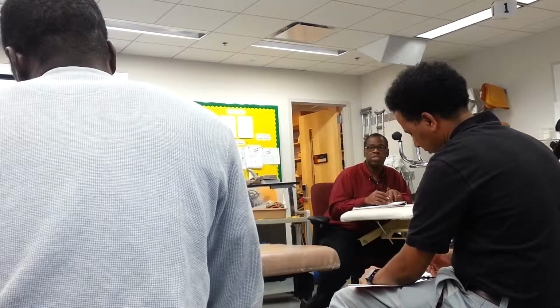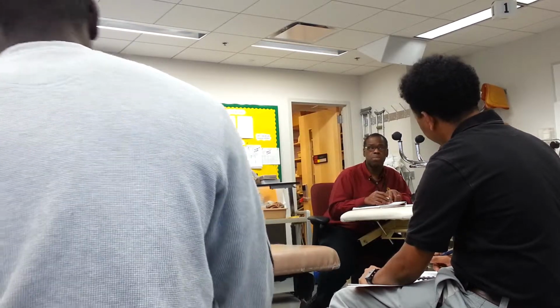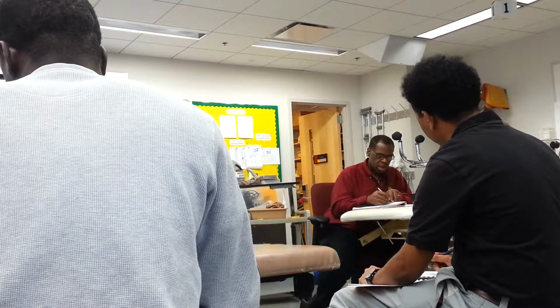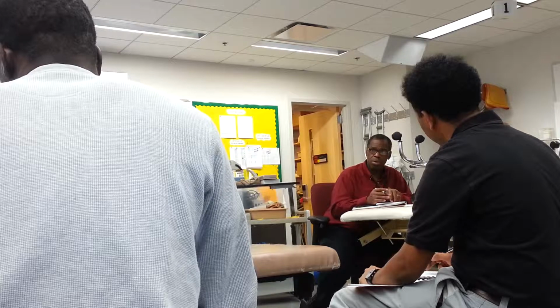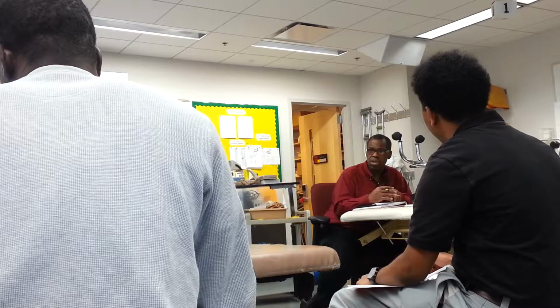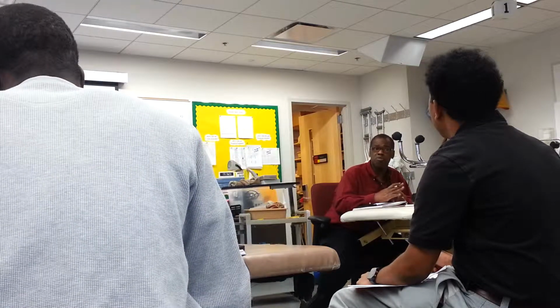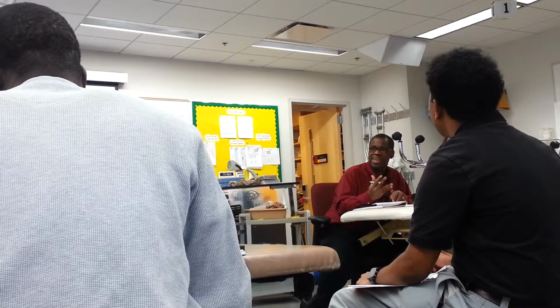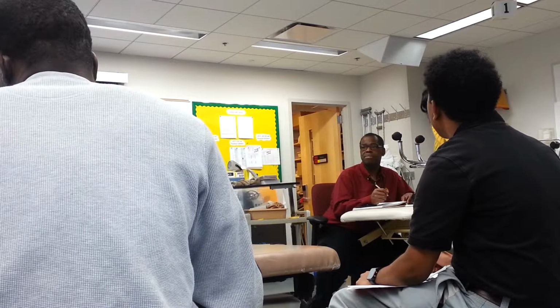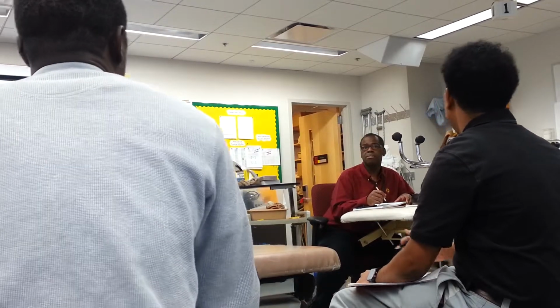So the lowest pulse width that we'll probably use is 50. The highest pulse width that we'll probably use is 200, 250, maybe even 300. So if I say that I want acute pain protocol, I want a low pulse width and a high pulse rate to get tingling. So low pulse width, no movement, high pulse rate, buzz, tingling. All right? What mode do I want? Reciprocate for acute pain. Y'all agree? Continuous.